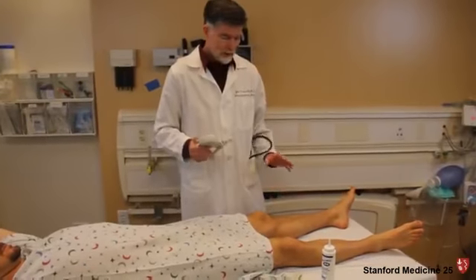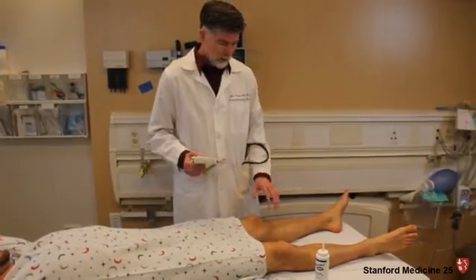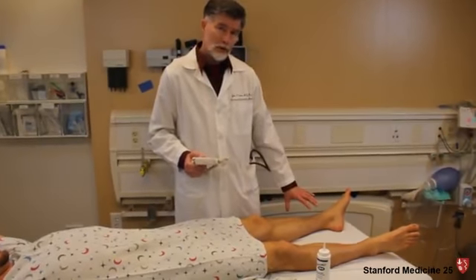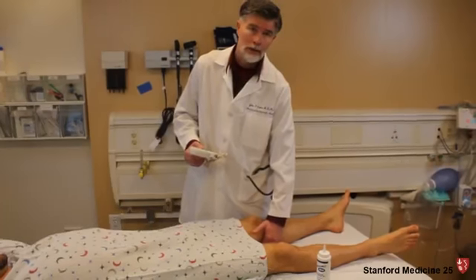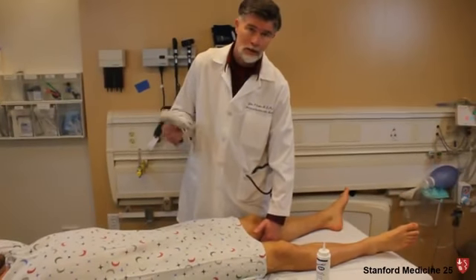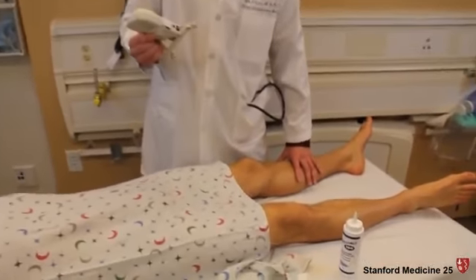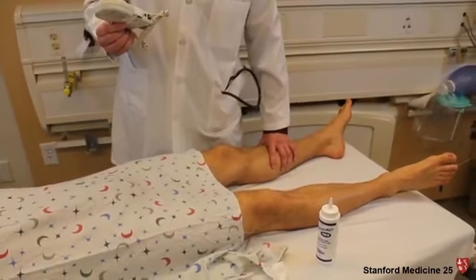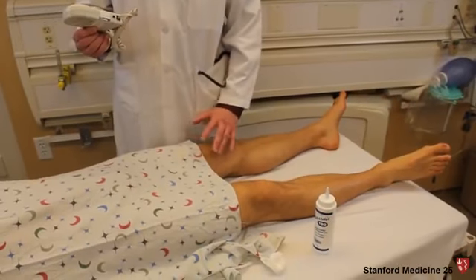So to complete the venous examination, you have to move up the lower extremity, and you'd want to do the same thing that I just showed you at the foot. You'd want to do that over the popliteal space. Listen for the popliteal artery signal with your Doppler, and then once you got that signal, then squeeze the calf, and you should hear a robust signal of venous return.